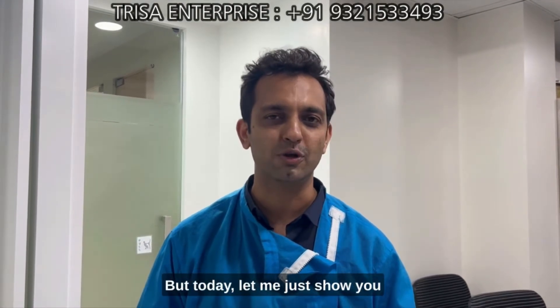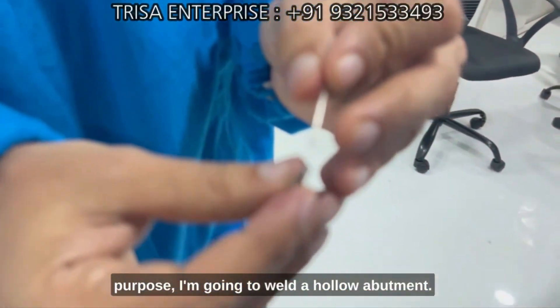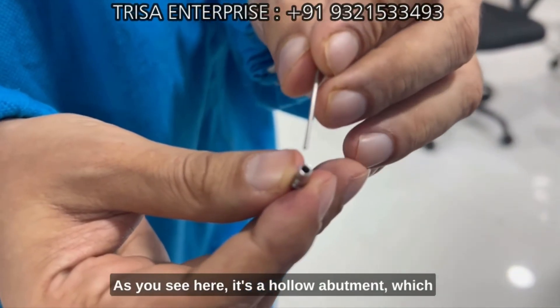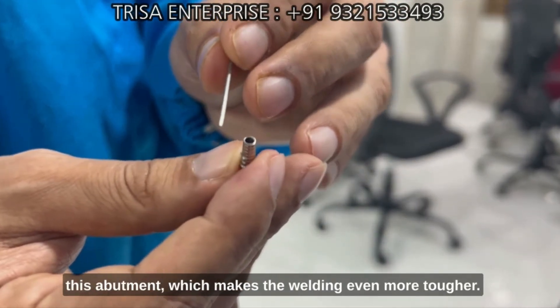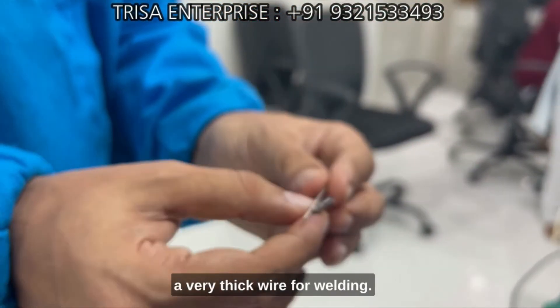Today let me just show you a quick working of the device. For demonstration purposes, I'm going to weld a hollow abutment — as you can see here, it's a hollow abutment, which means that the current is going to pass through it, making the welding even more challenging. I've also taken a very thick wire for welding.